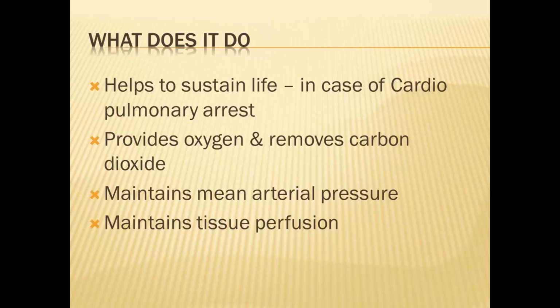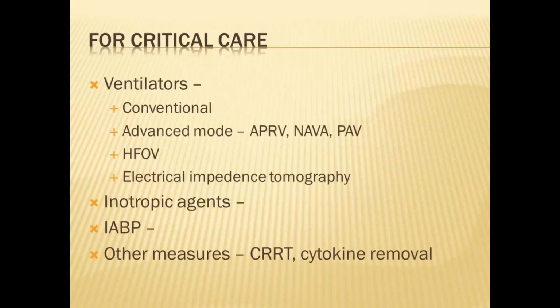In case of cardiopulmonary arrest, if you put a patient on ECMO, you will be able to sustain the life till the time you diagnose the problem and treat it. It provides oxygenation and removes carbon dioxide, so it helps in gas exchange, it maintains the mean arterial pressure, and it maintains the tissue perfusion.